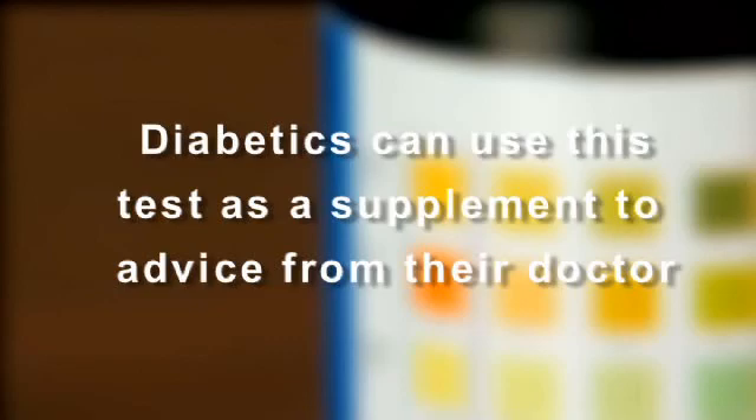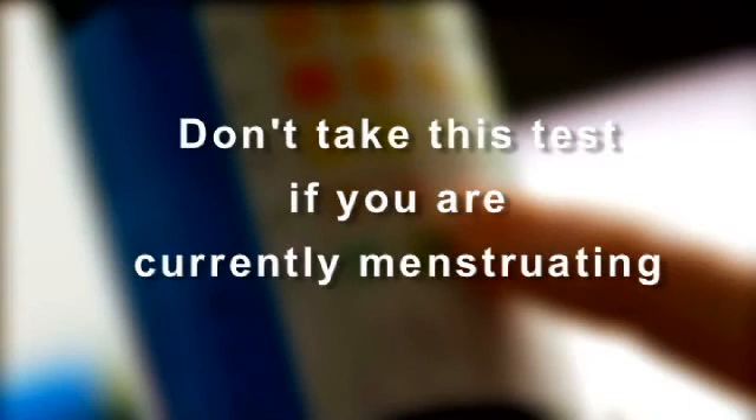If you already know that you're diabetic, feel free to use this test as a supplement to what your doctor has advised. First, remember: if you're currently menstruating, there's no need to take this test until you reach the next stage in your cycle.